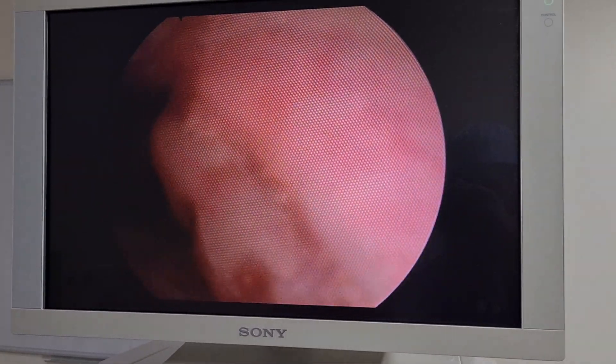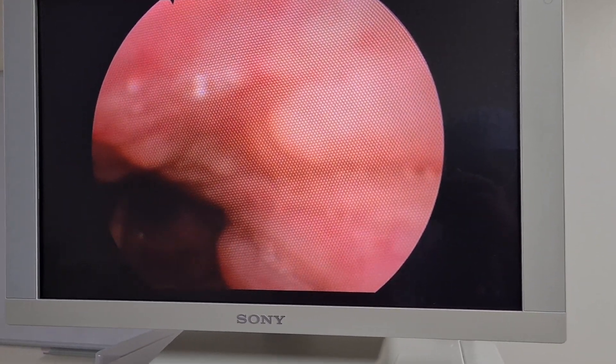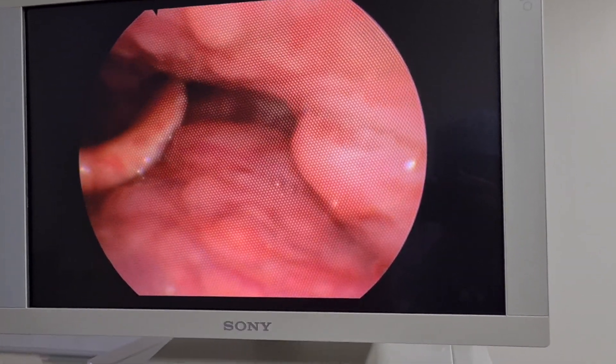We're just going to go down and try not to touch things too much to get the view. Just going to look down a little bit, try to elevate the epiglottis, and neck back in the middle. Well done, Tom.